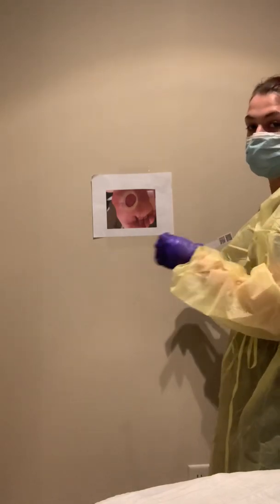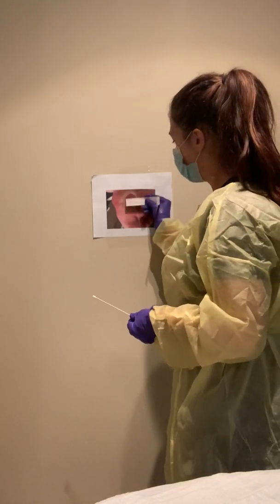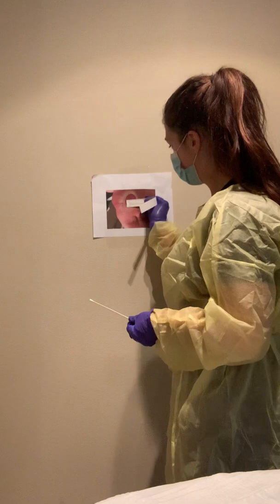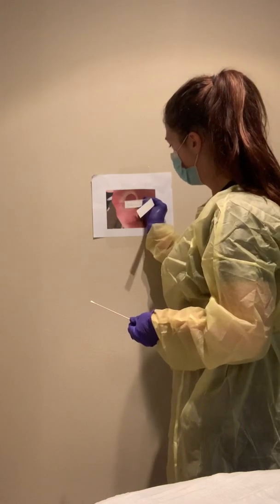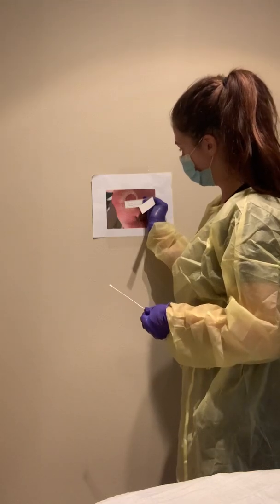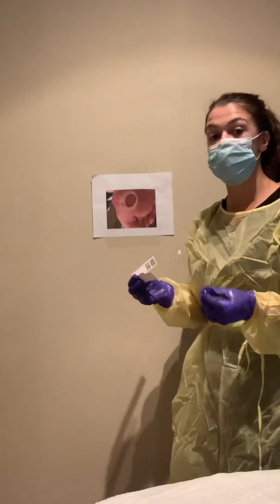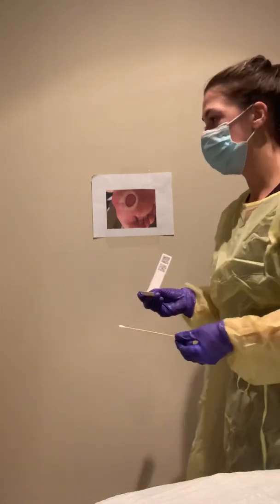So now in order to take the width, I'm looking for the widest part of the wound running in the medial lateral direction. I'm gonna go ahead and find the widest part of the wound, come up onto the edge, right where the wound ends and the edges are that you see, and I'm gonna go ahead and take it all the way to the other side, and here I get 3.7 centimeters.